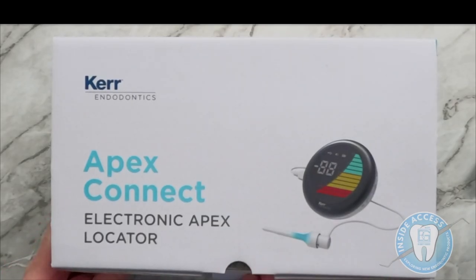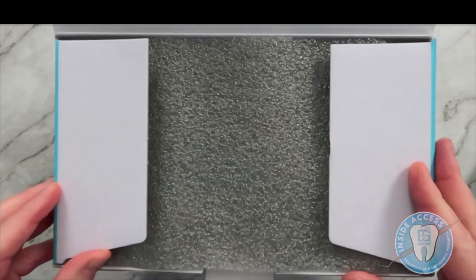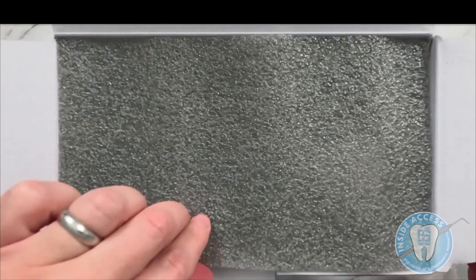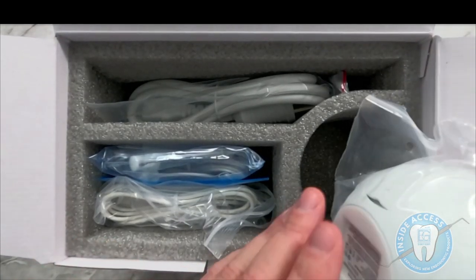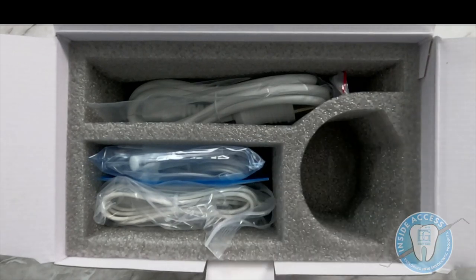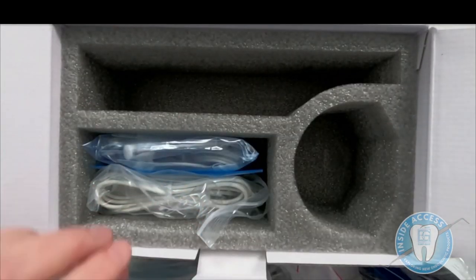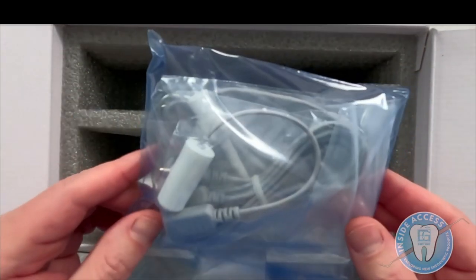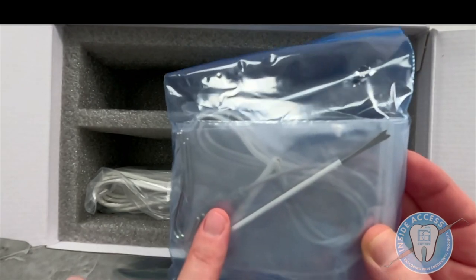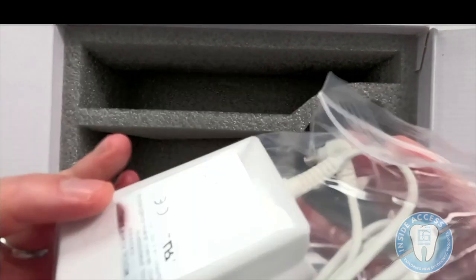Here we are with the Apex Connect electronic apex locator. Let's take a look at what's in the box. When you open it up, you're going to find several different components: the unit body itself, a power cord, a collection of lip and file clips, and also a probe, which makes it really easy to utilize the unit.